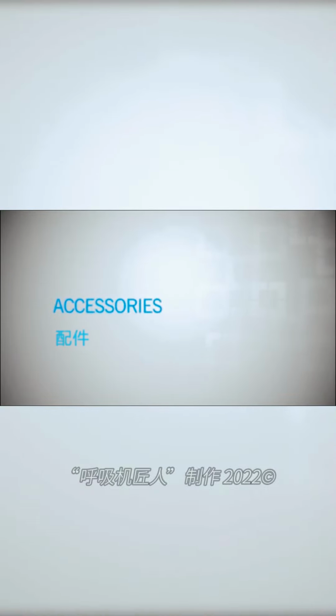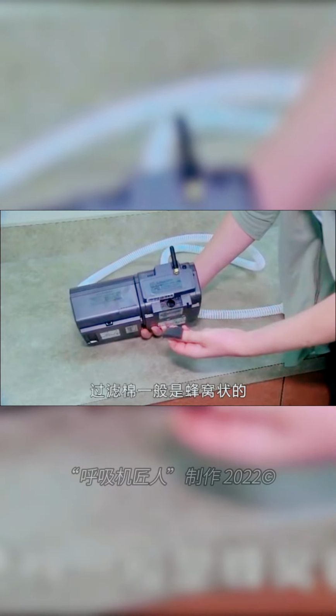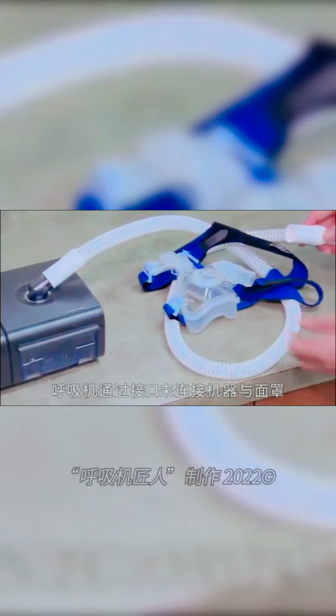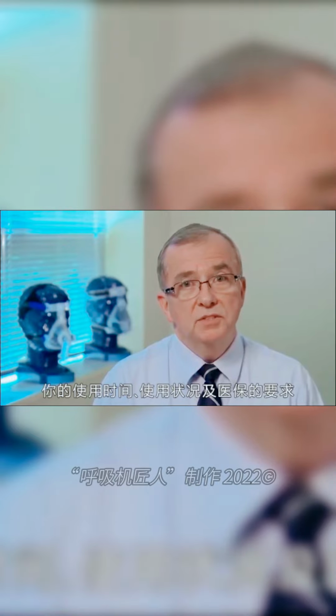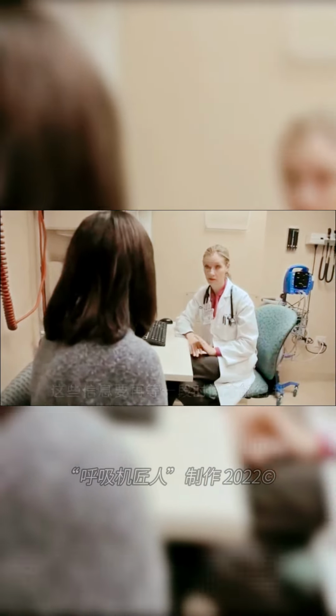Your PAP machine requires a filter to protect you from dust. This filter is usually foam. A second optional ultrafine filter may be provided to help trap particles that may trigger allergies. PAP tubing is connected from the outlet of the machine to your PAP mask. Attached to the back of the PAP machine may be a modem or an SD card. This can be used to create a report of your PAP usage, which your physician or insurance company may require at a later time.